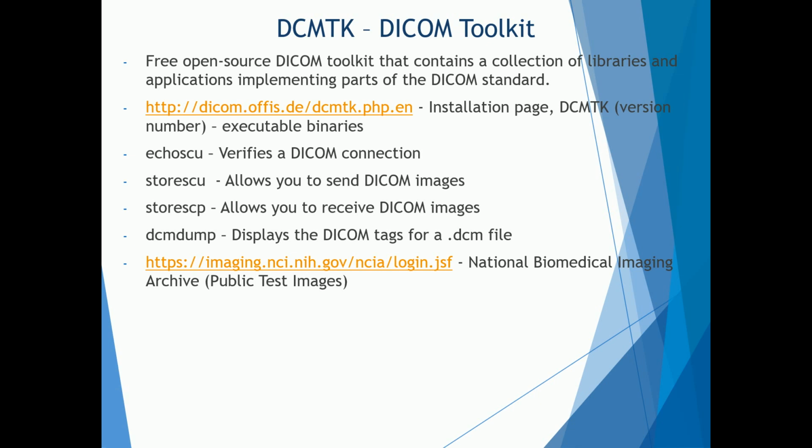So it pretty much allows you to implement parts of the DICOM standard, such as a few listed here below, such as the echoscu, which verifies a DICOM connection. As we saw earlier in one of our intro training videos, when you verify a DICOM connection, the first step is establishing an association.